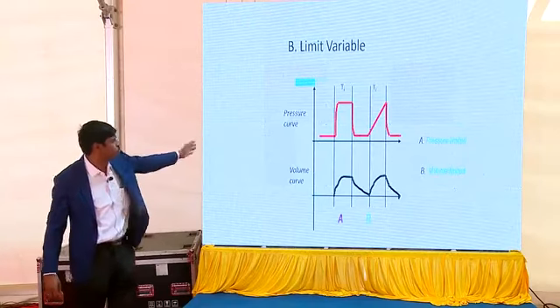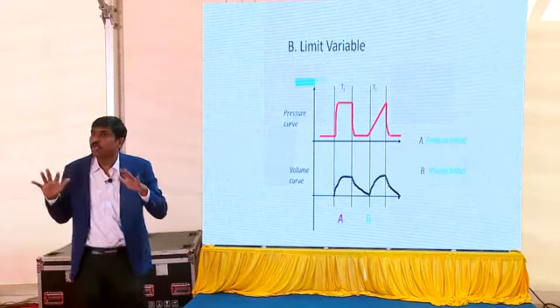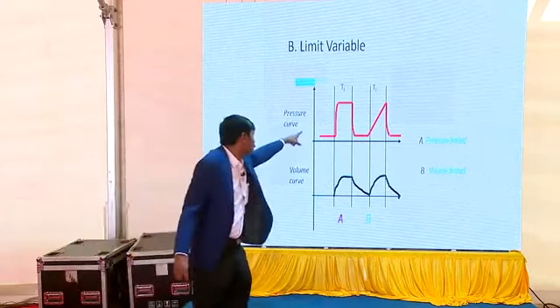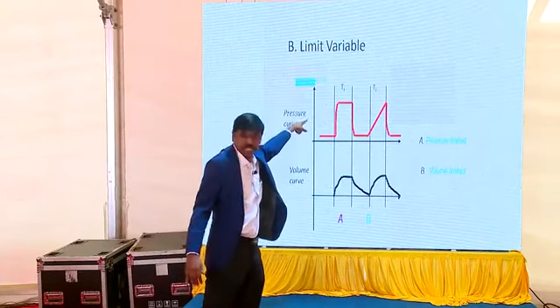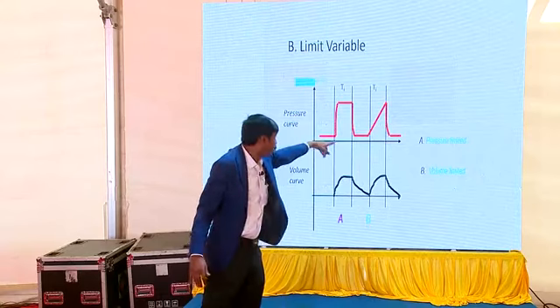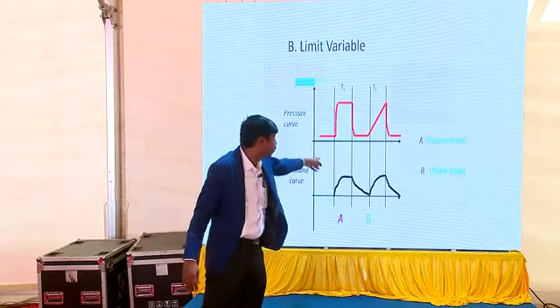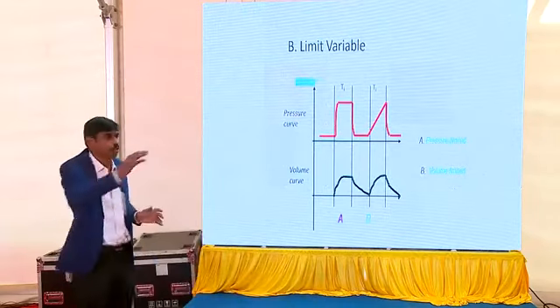The limit is very simple. You either limit your pressure or you limit your volume. In the first curve you see that the pressure is reached, and then the pressure doesn't cross that. The second one is the volume, where you achieve a volume, but here the pressure rises slowly. I think during the graphics session they'll teach you about this. Next one.